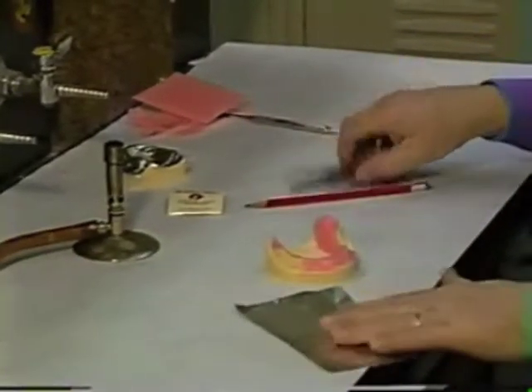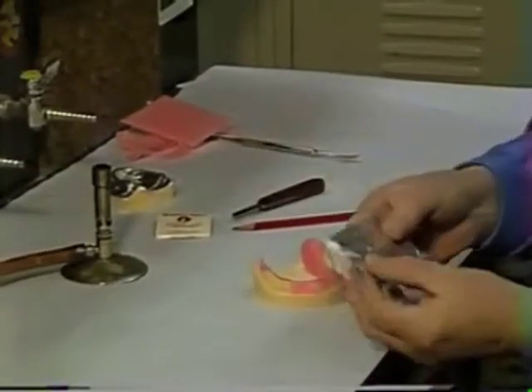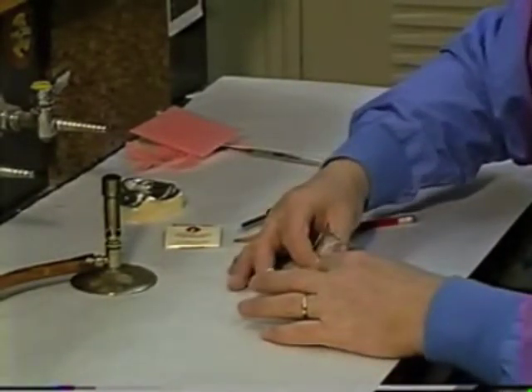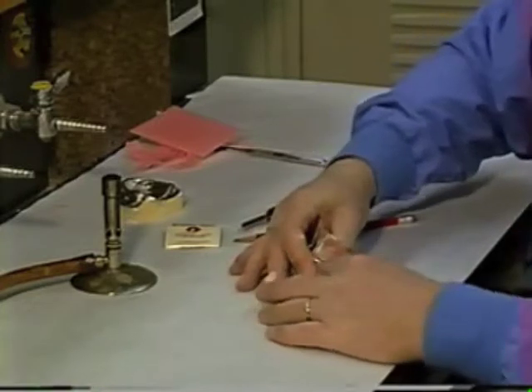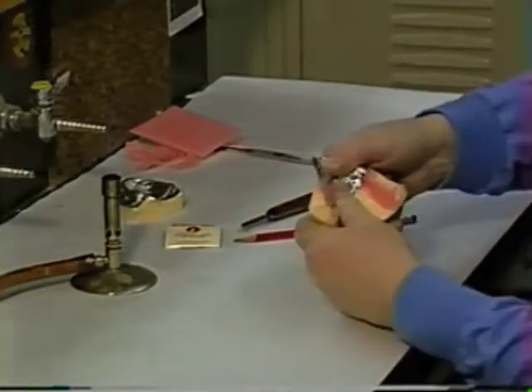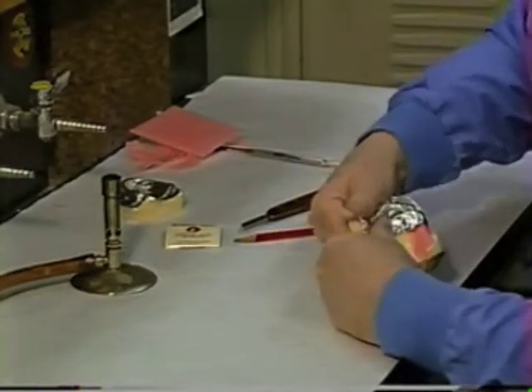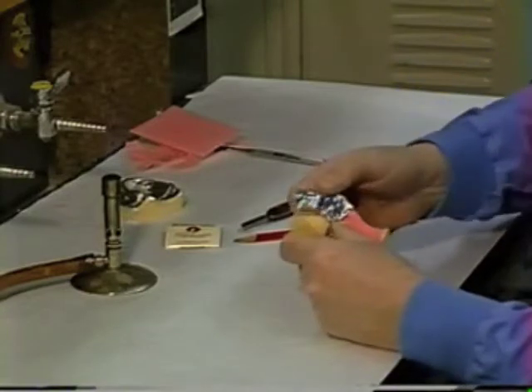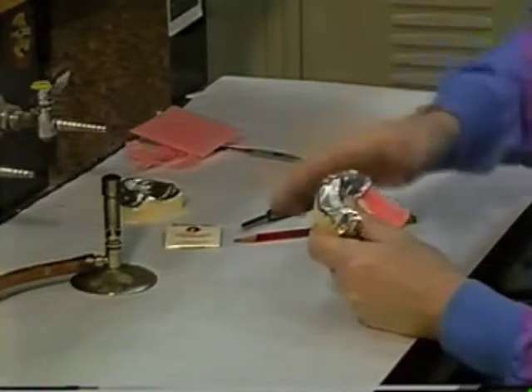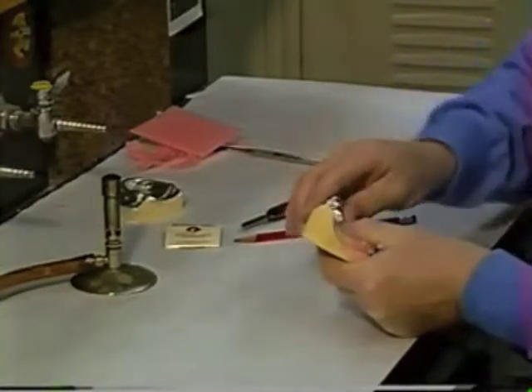And now let's take about a piece like so for our first adaptation of the tinfoil, and we'll lay it onto the cast on one side and rub it in with the finger till it's adapted in very nice and smooth, as smooth as we can get it, and over the cast all the way down, including all the way out to the periphery. And I usually bend any excess down over the edges, and that helps hold it in place.